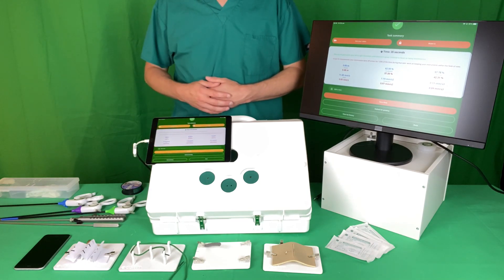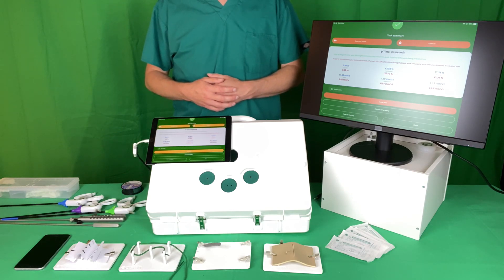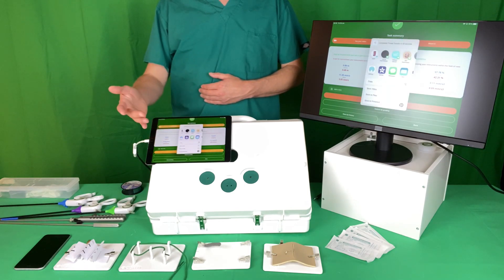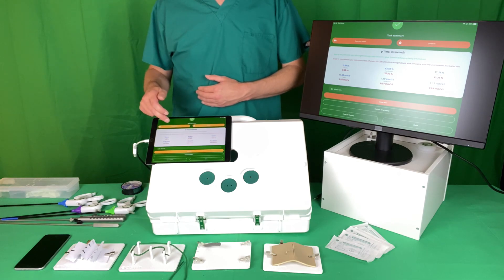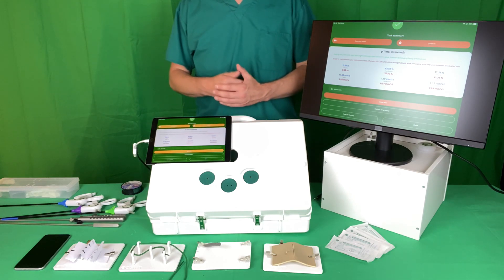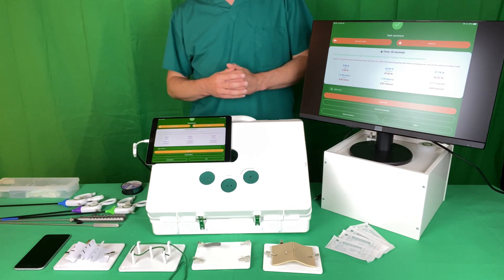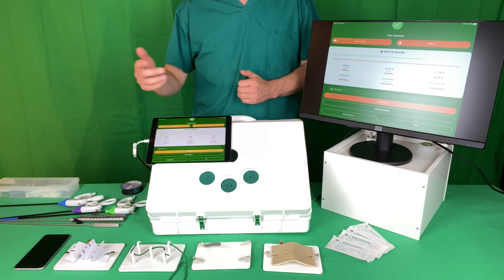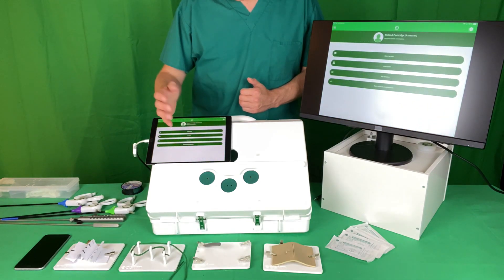You can share your task if you think you did a procedure particularly well or have a technique you'd like to share with others — click share and that opens up all the usual sharing options. You can also see your video if you want to review what you did; for example, if laparoscopic suturing seemed to flow more easily than before, just click see your video, re-watch it, and then click done.